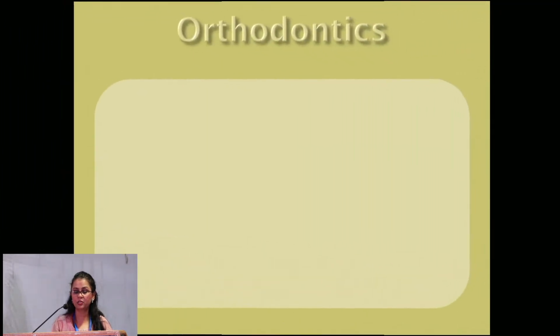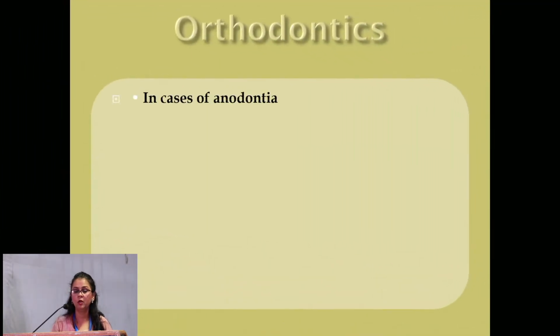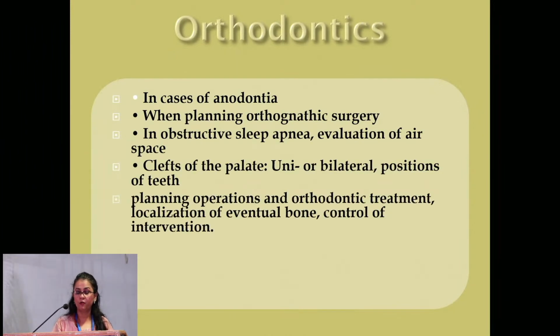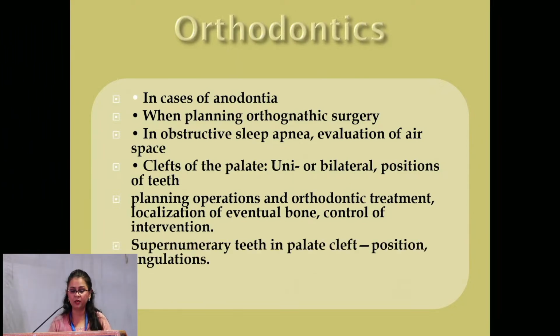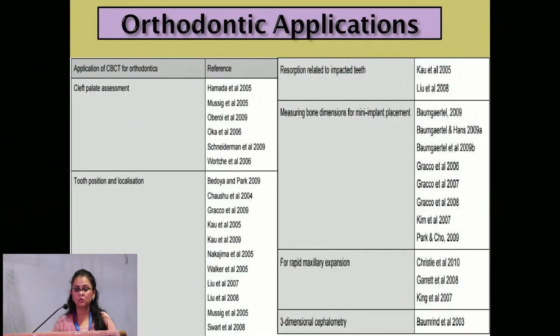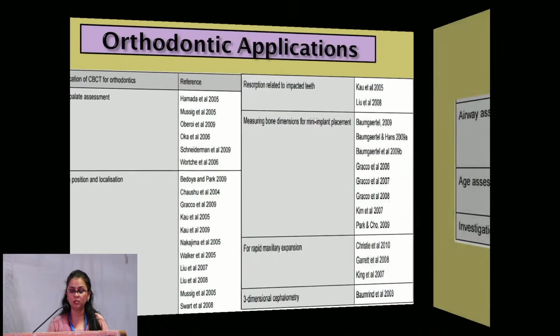For a condylar fracture, even CBCT is useful. For orthodontics, for cleft lip and palate, I get many cases where I am doing research. You can even do the morphometric measurement; how much bone you're supposed to put inside can be determined. A volumetric measurement can be done. Cephalometric analysis can be done. So there are a number of orthodontic applications that can be done on CBCT.